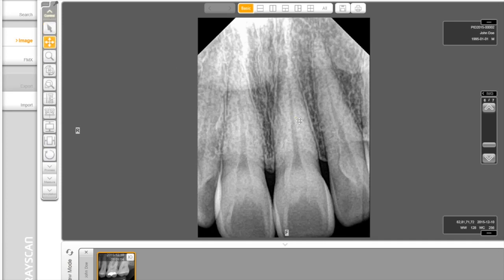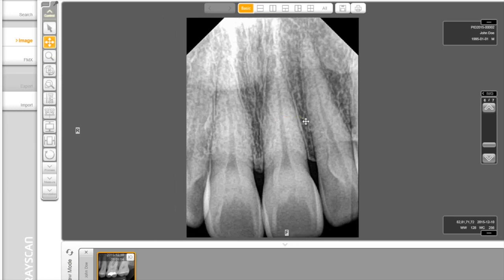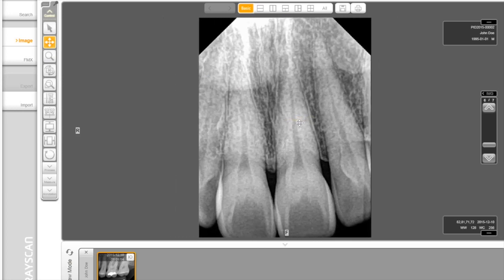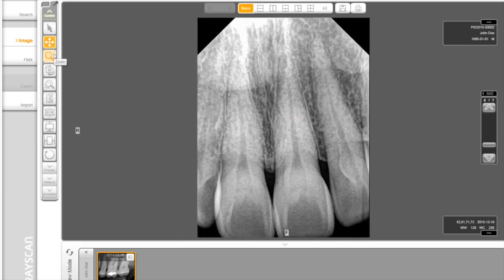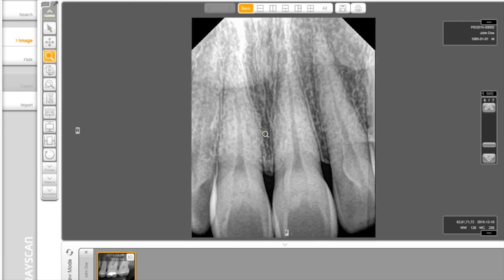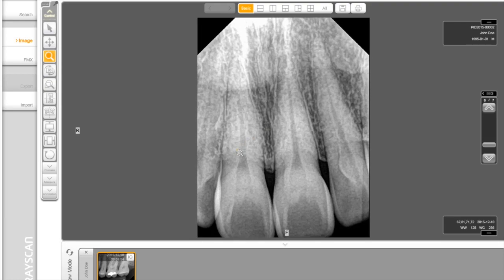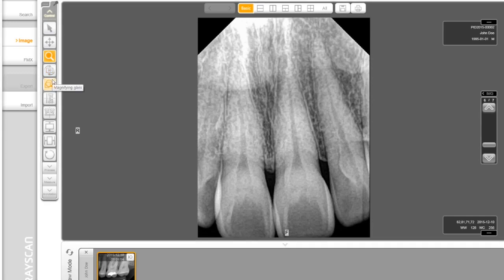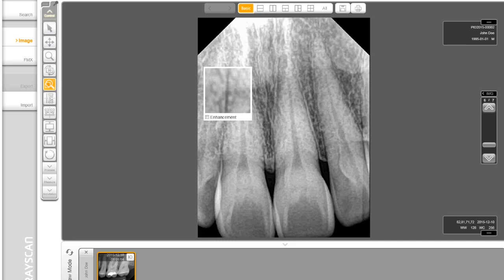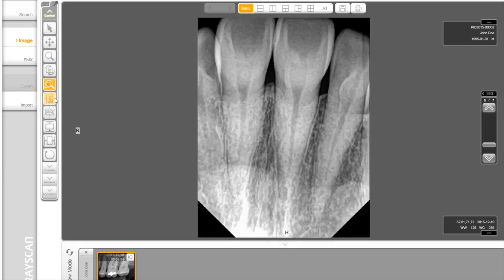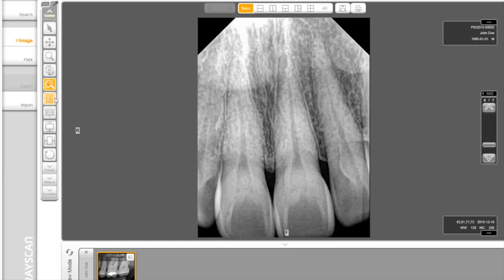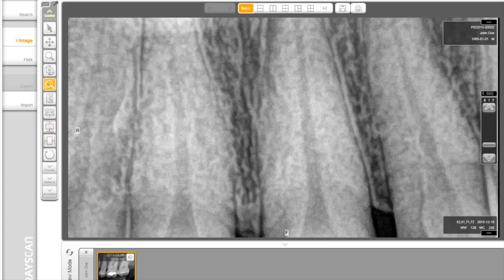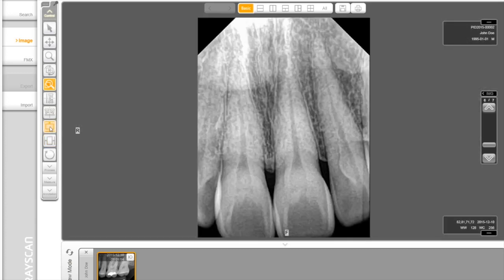If you are single left clicking on move, this allows you to move the image you want. You can also go to zoom. This tool allows the user to click and drag on the image to zoom in and out. Below is Rotate Tool. The Spot Magnifier button will zoom into a user-specified area of the image by clicking and holding the left mouse button. To flip the images, use vertical and horizontal flip buttons. Fit the Screen button will make the image fit within the exact size of the window, to vertical and horizontal as well.